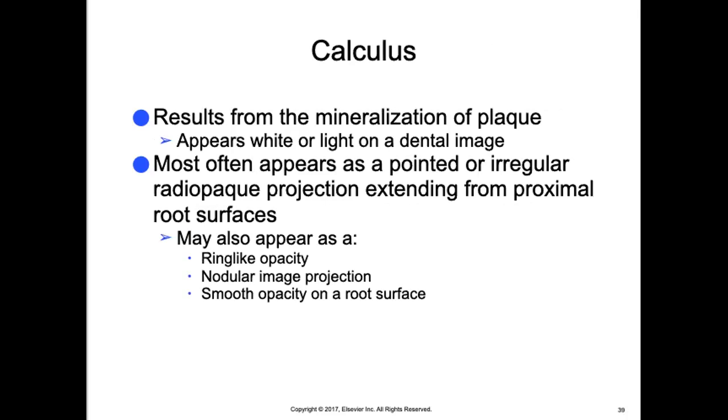Calculus results from the mineralization of plaque. So when people leave plaque on their teeth and do not take it off, that soft, sticky stuff that we can sometimes scratch off with a fingernail, that actually becomes mineralized and hard, and it's something that needs to be scaled or scraped off the teeth. So it'll appear as a white or light area on a dental image.